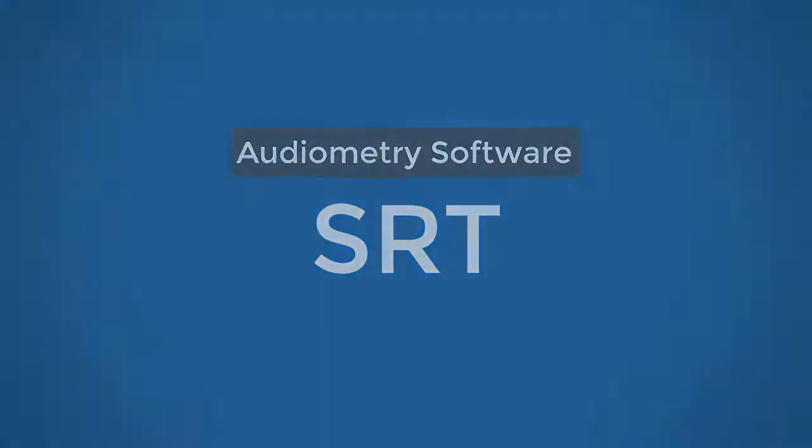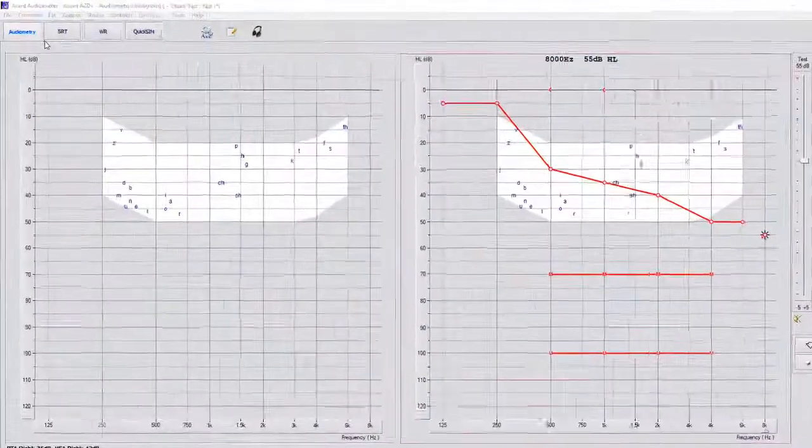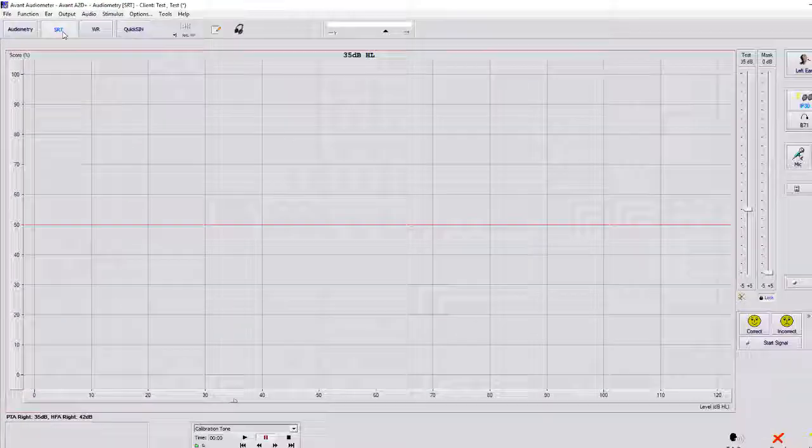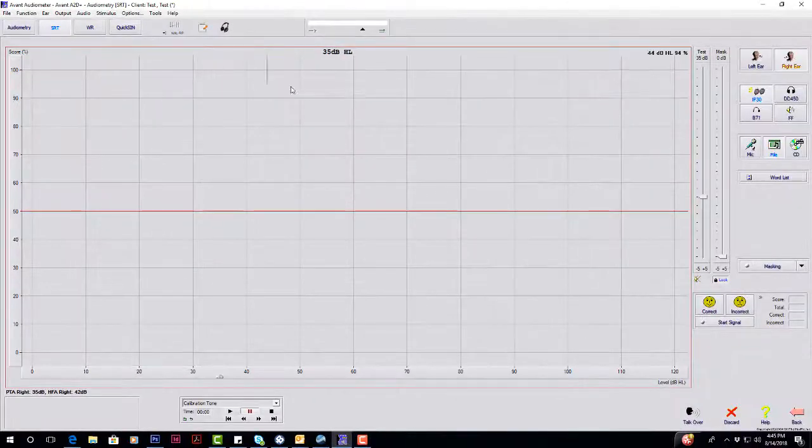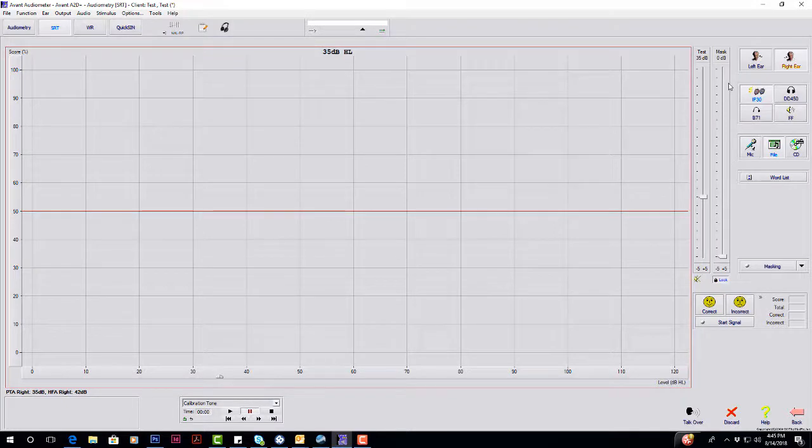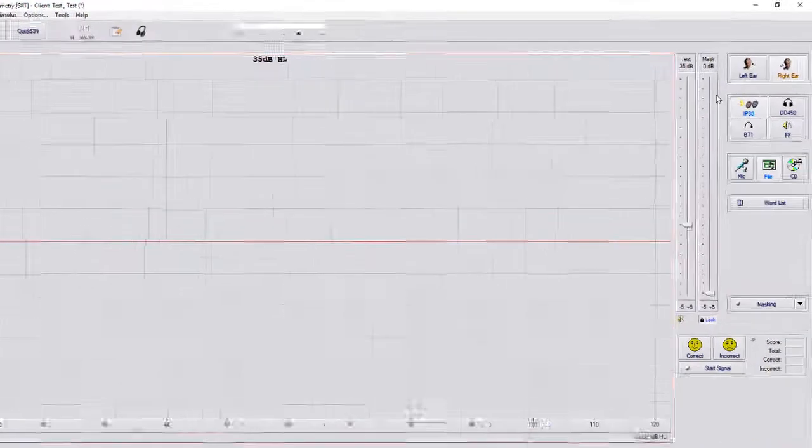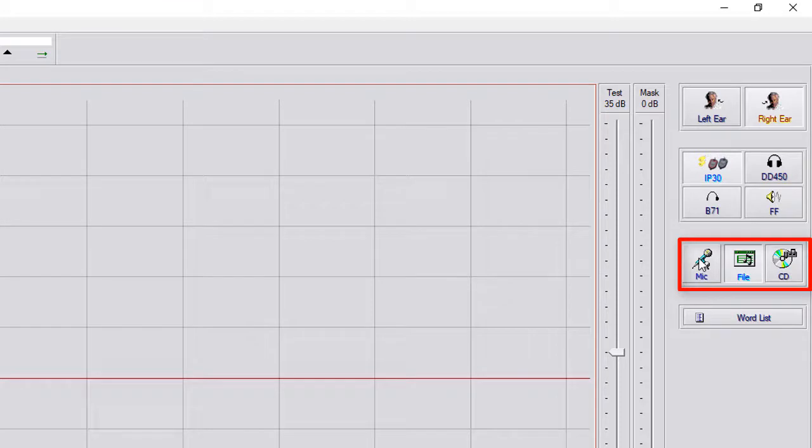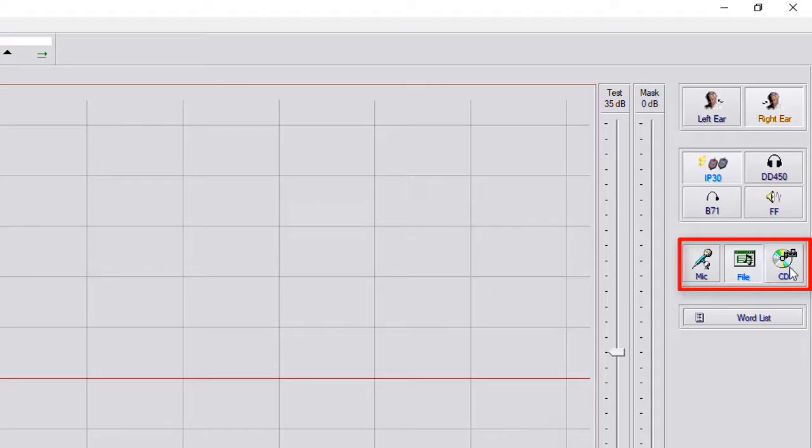Alright, next on our list is going to be SRT, and within SRT you have three options. You can use microphone, which is going to be the toughest, and you have the built-in files which is what we recommend, and if you have your own specific CD you can use that as well.